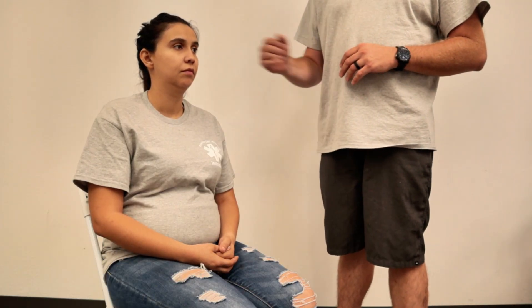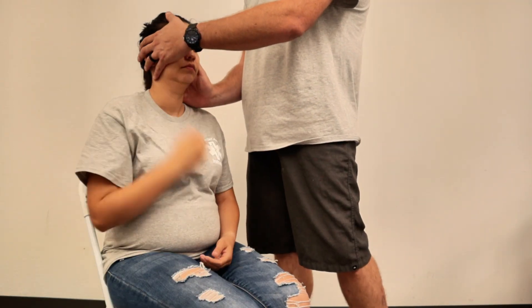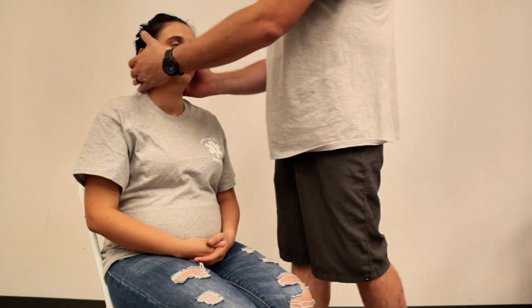All right, so today we're going to mobilize her in a seated position with the KED, or the Kendrick Extrication Device. As always, we've got our PPE on, our scene is safe, patient is complaining of some neck pain, maybe some upper back pain. I'm going to ask my partner to come hold manual stabilization, as well as try and stabilize and place the head in a neutral position, so they'll be standing behind and holding on to her neck.